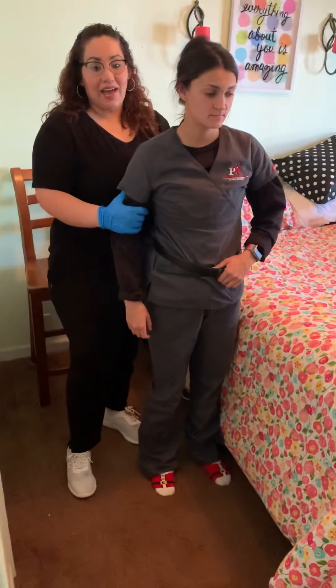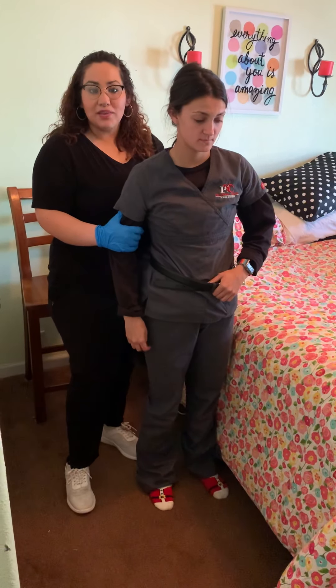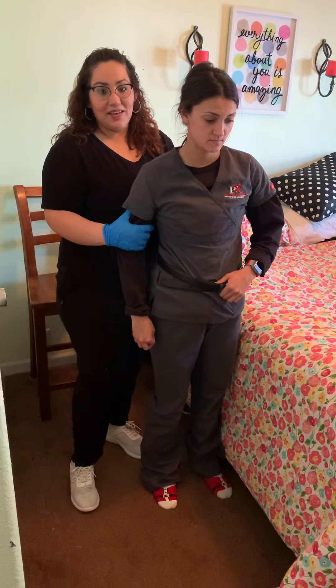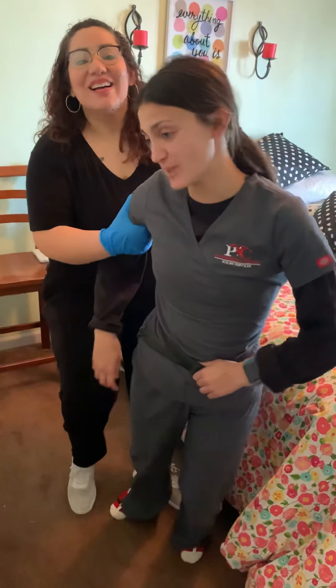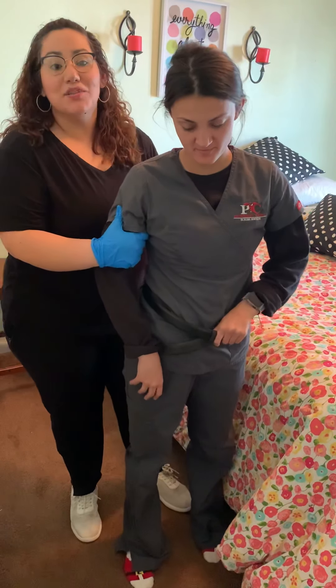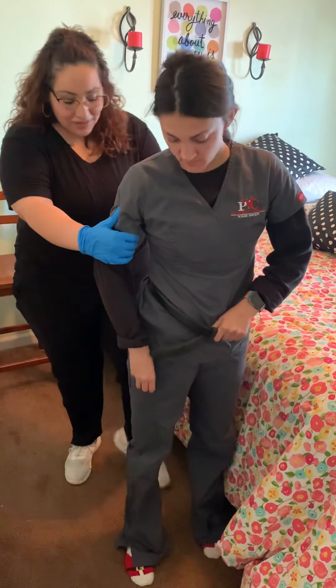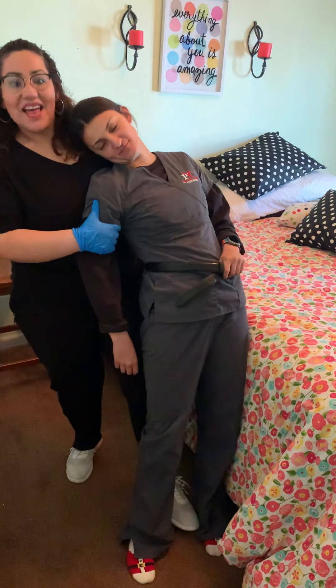Are you ready to get up? On the count of three, we'll get up. You have to make sure that you hold on to the back of the belt. One, two, three — up. Are you dizzy? Are you okay? When you start walking with them, you want to make sure to hold on to them on the strong side, that way you don't hurt the weak one. So we're going to go ahead and start walking.